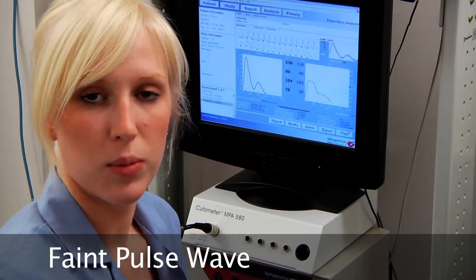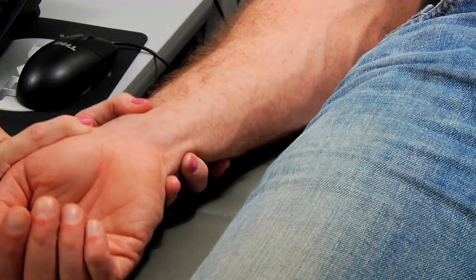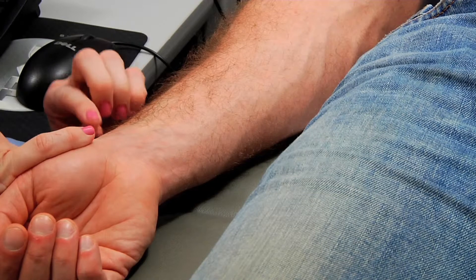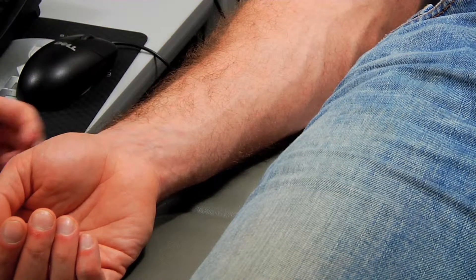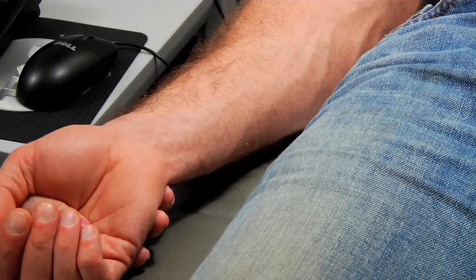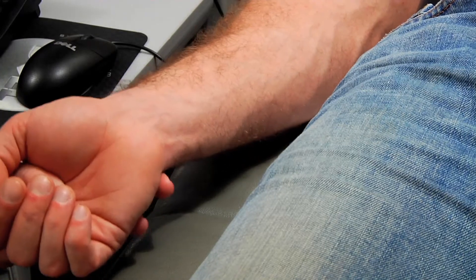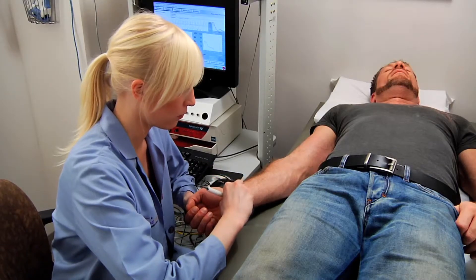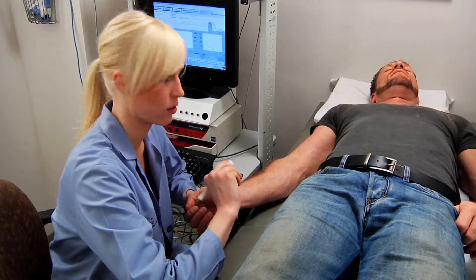One reason you might not get a good measurement is because the patient may have a faint pulse. If they have a faint pulse, you'll want their wrist to be flat. To get those faint pulses closer to the surface, hold their hand, put your thumb in their hand and use your left index finger to control their arm, then bend their wrist back. That will bring the pulse a little bit closer to the surface so you get a stronger pulse.